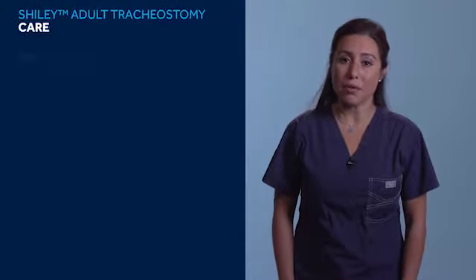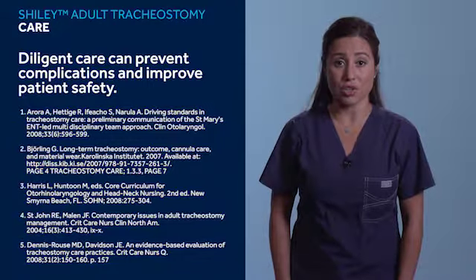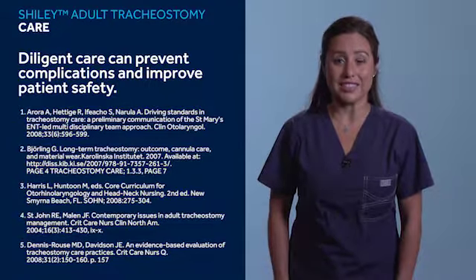Ultimately, as with many medical procedures, diligent tracheostomy care can prevent complications and improve patient safety. Remember, confidence and competence equals improved care.